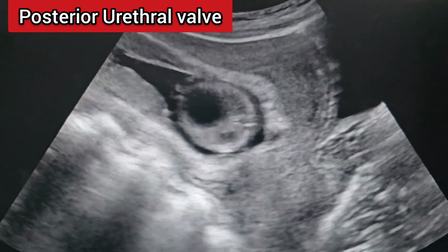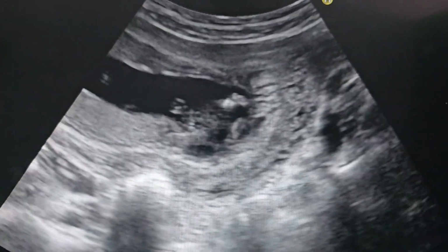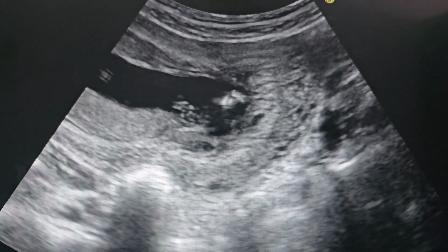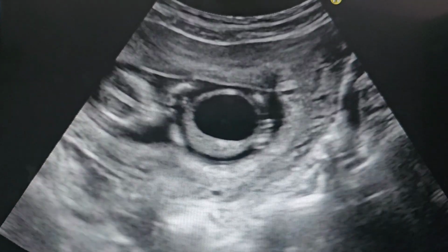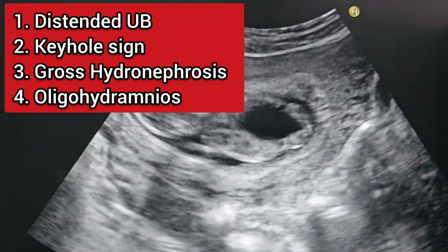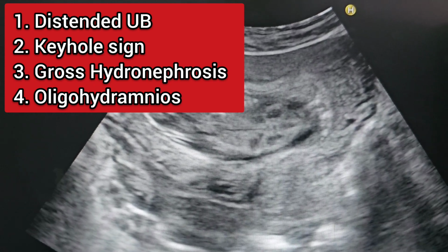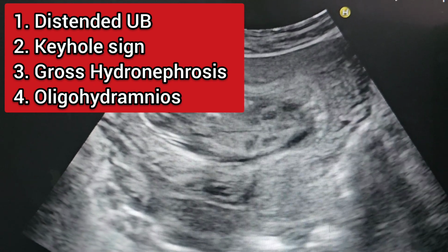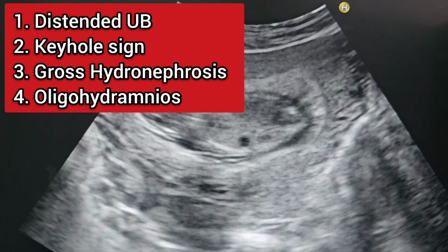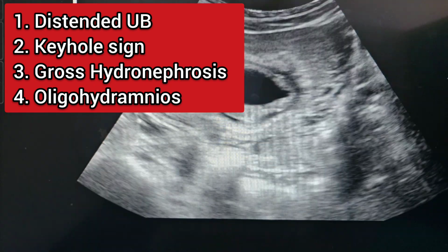the prostatic urethra, and this occurs usually in 5 to 7 weeks of gestation, but is usually diagnosed after 24 weeks of gestation. And in the antenatal period, the key signs on the ultrasound are a hypertrophic, distended urinary bladder with keyhole sign, and there is associated gross hydronephrosis with hydroureter and oligohydramnios. But unfortunately, all these signs are visible only after 24 to 26 weeks of gestation.